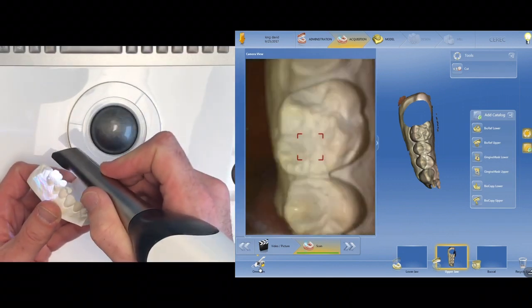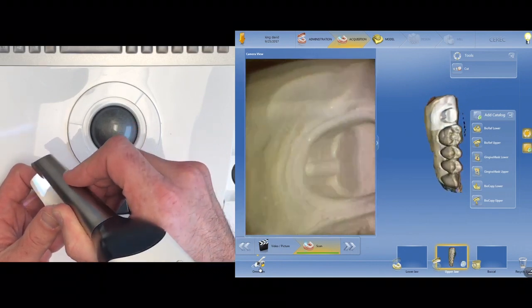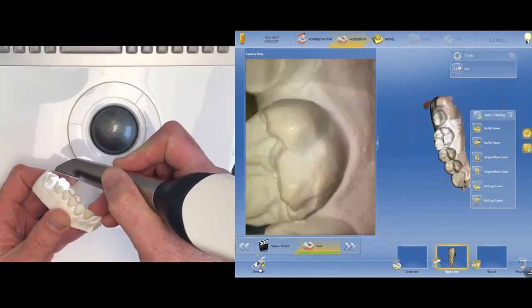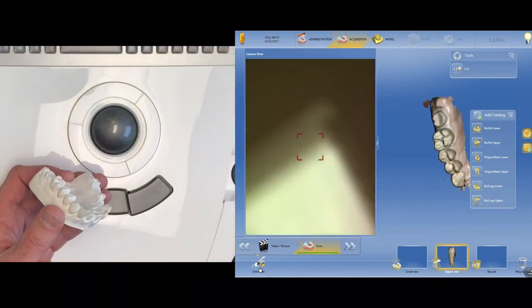And then I'm going to grab some common data. And you can see the computer recognized that. That's where it starts to track on the image on the right side. And then I'm going to plug in that common data. Now you want to overlap just a little bit to make sure the computer has enough data to correlate those images together. And get the image, and there you go.